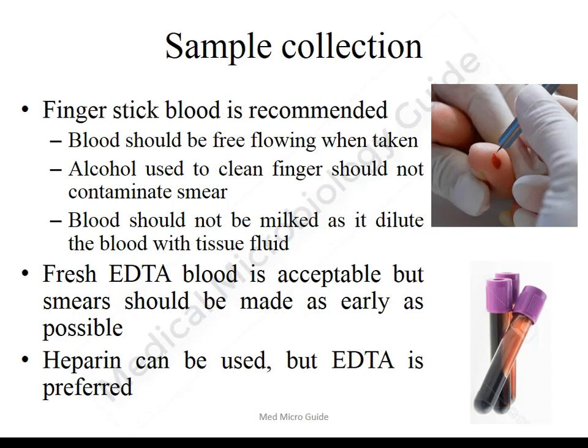The finger is cleaned with alcohol, and with the help of a lancet, prick the pulp of the finger and collect the free-flowing blood. The blood should not be milked, as milking will cause squeezing of tissue fluid which will mix with and dilute the blood. The alcohol used to clean the finger should not contaminate the blood, because the smear can fall off during the staining procedure.